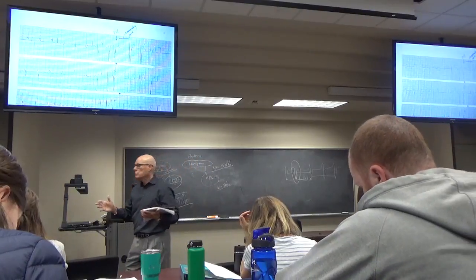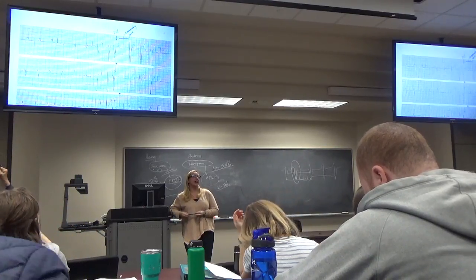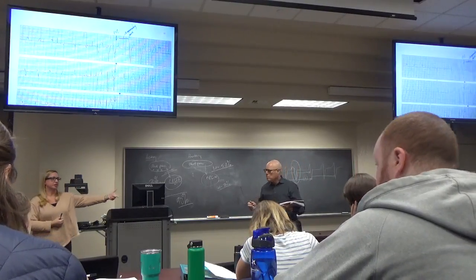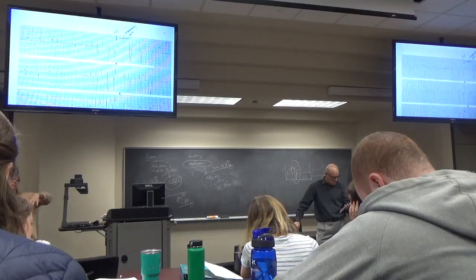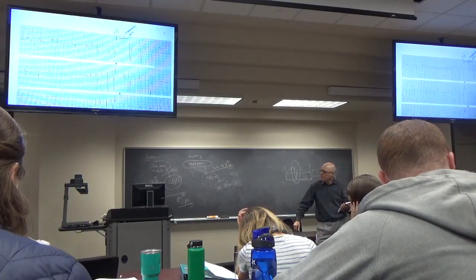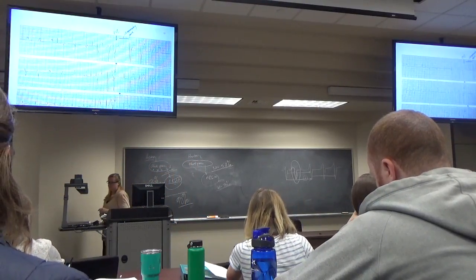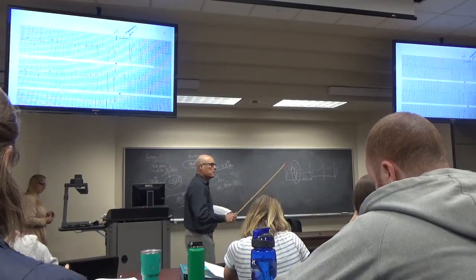Anything else? We were discussing this one because I had a couple of students ask me last week to look at this one particularly. And you actually have biphasic P waves in V1 and V2, which also tells you that you've got atrial enlargement by rule. And just like he said, we've already ruled that you've got left ventricular enlargement, so you've got atrial and ventricular, so it's full force in the heart. Overall enlargement, cardiomegaly, so you would expect to possibly see that on the chest X-ray as well. So you have to put both pieces together. That's a good term. Cardiomegaly means a big heart. It's a term used to describe a chest X-ray, not an EKG. Right. But we can see atrial enlargement and ventricular enlargement on the EKG.